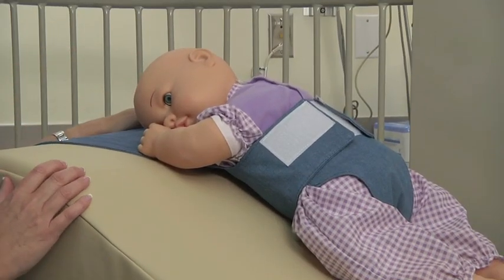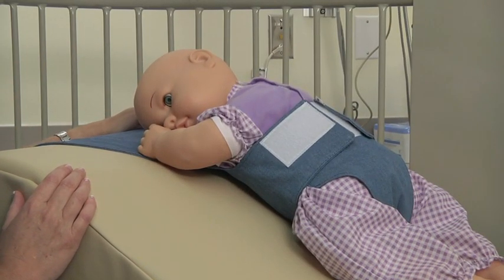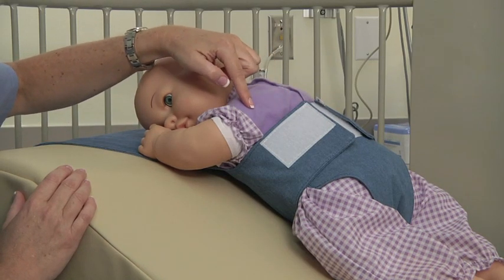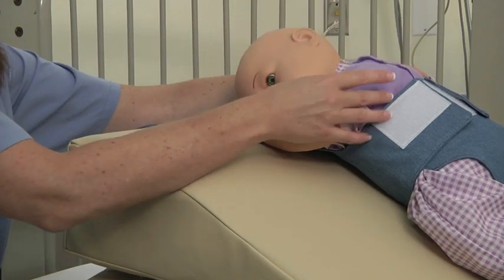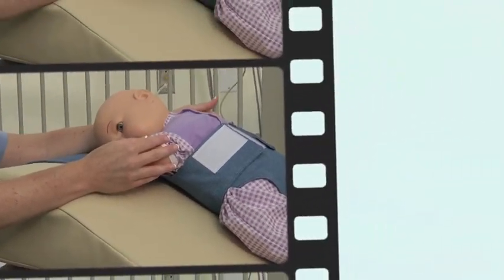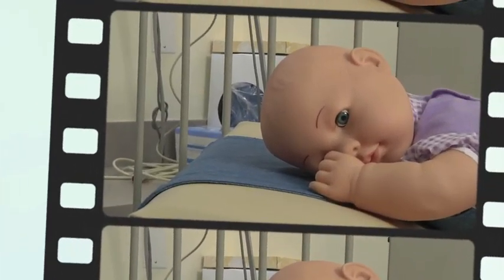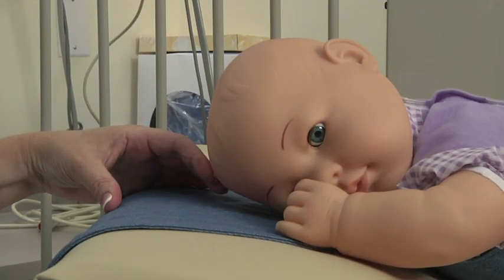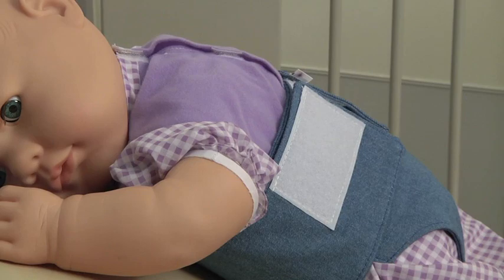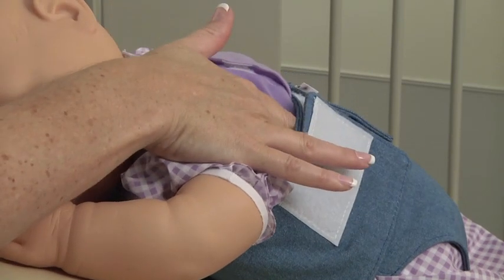We're going to look at how the sling fits the baby. You want to make sure that the sling does not come up under the baby's armpit. You want it to fit like a diaper. The baby's shoulders should lie gently forward on the wedge. The baby's head should be two to three inches from the edge of the wedge. You should be able to fit two fingers in between the baby and the sling.